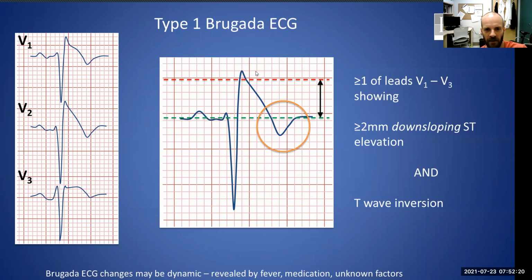In this case, you can see that there's a change in the angle. It's a relatively sharp downstroke here that then becomes a little shallower. And so that's where I've marked the J point here, but it can be difficult to tell exactly where the J point is. I agree that can be a tricky thing, but it doesn't have to be horizontal.